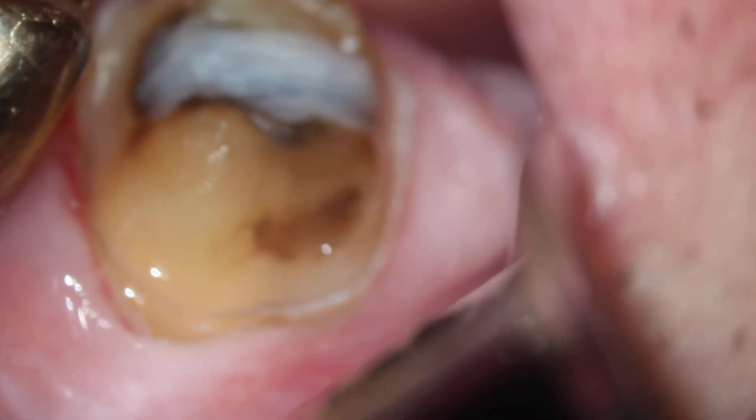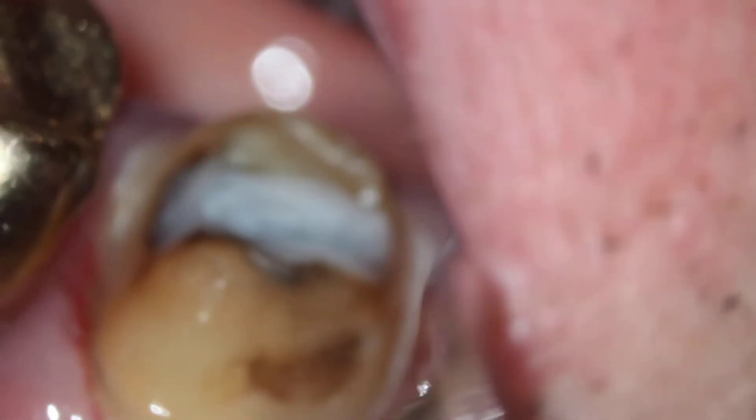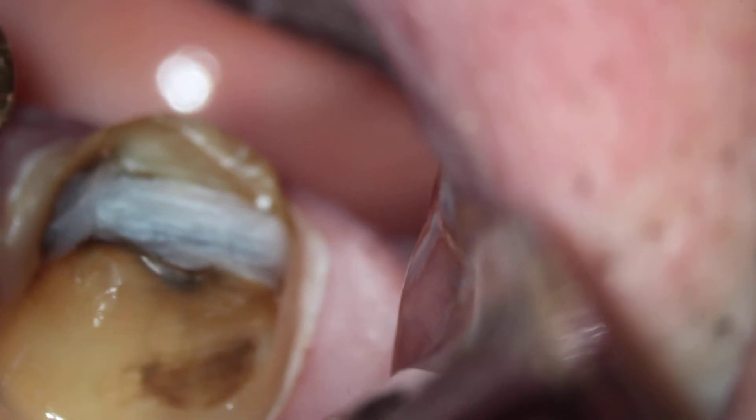There we can see the entire mesial margin. Turn away from me a little more, Dean — thank you. Mesial margin wrapping around to the palatal. There we can see the entire distal margin. Dean, would you turn towards me please.